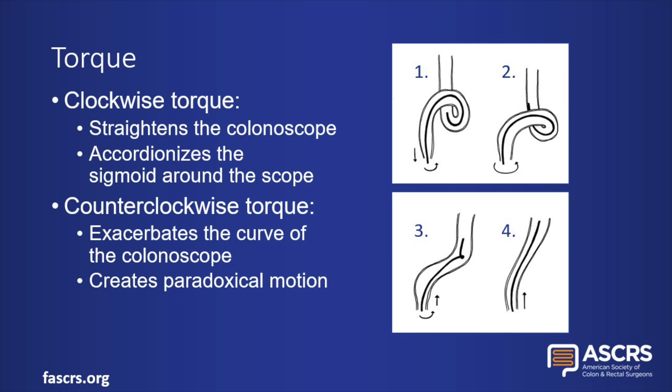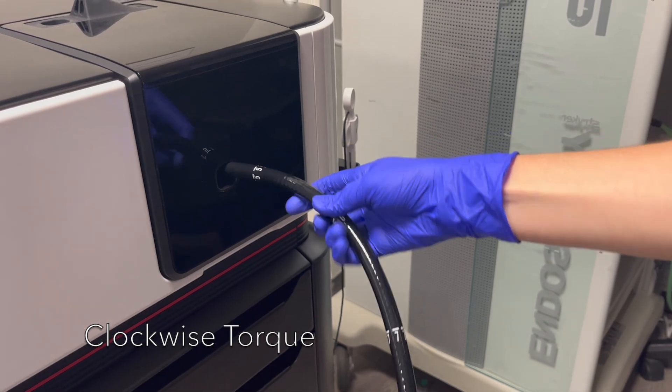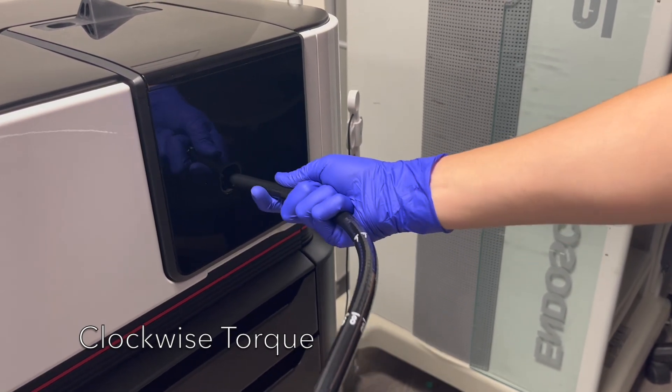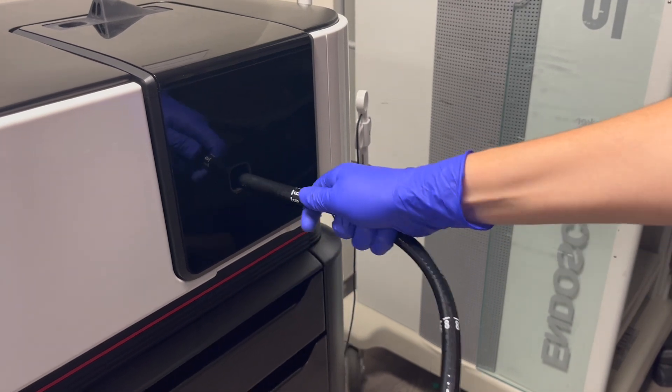Counterclockwise torque, on the other hand, would exacerbate the curve of the colonoscope. This creates the effect of paradoxical motion, which causes the tip to withdraw relative to the surrounding colon. Torquing to keep the lumen in view can be more effective than deflecting the tip, and torque in combination with one deflection wheel is often more effective than a combination of both wheels.